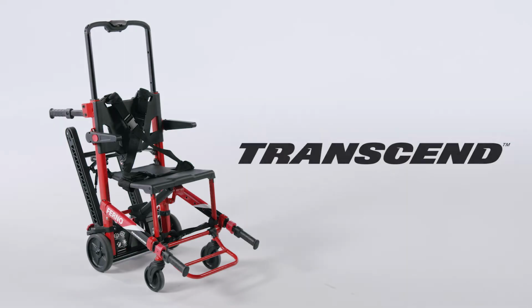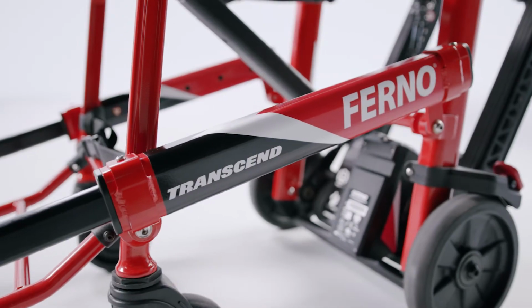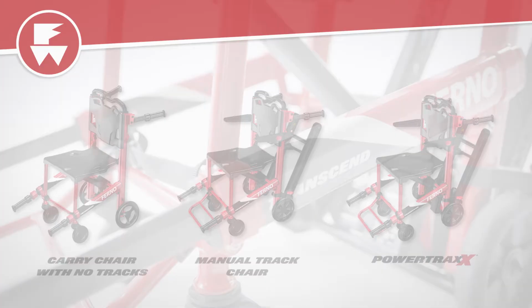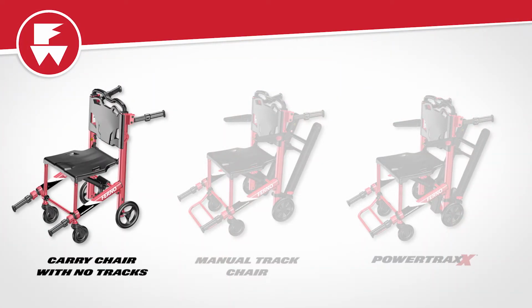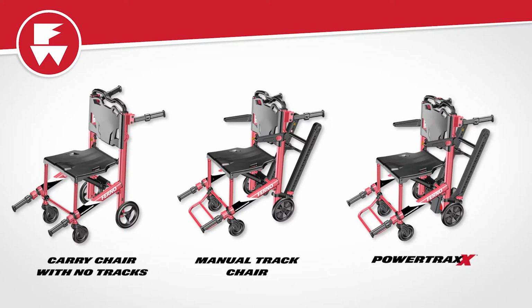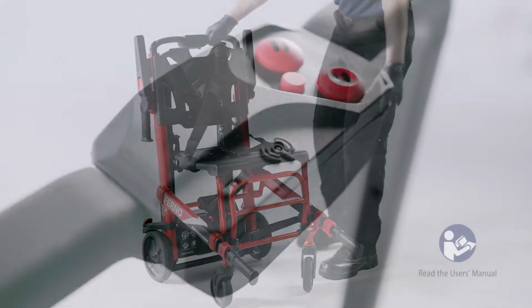Welcome. This video contains general instructions for the use, operation, and care of the FERNO'S Transcend series chair. There are 3 Transcend chair models available: carry chair with no tracks, manual track chair, and PowerTraxx. Before using the Transcend chair, read and understand the user's manual.